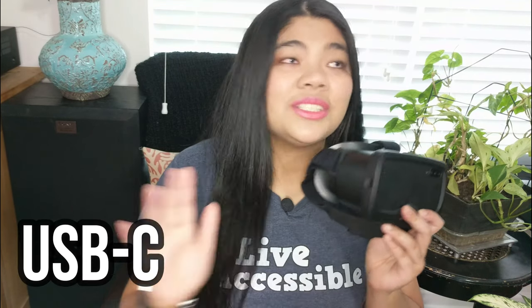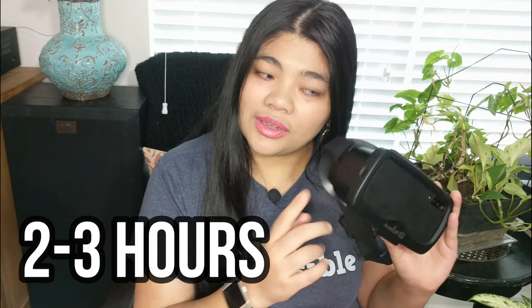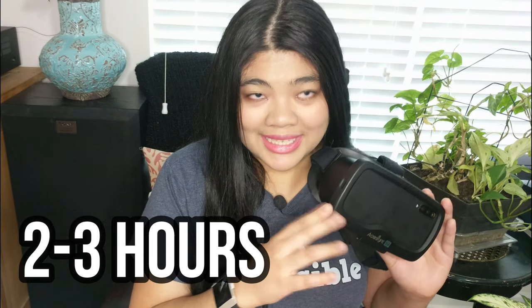And then there is the charging port on the side. Here it uses a USB Type-C connector, which is great because you can reverse it and you don't have to worry about the correct direction that you plug it in. The battery life on the device is around 2 to 3 hours continuous use, or you can also use it while it's plugged in. Then you have some controls here at the top.